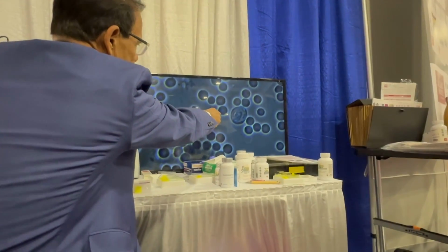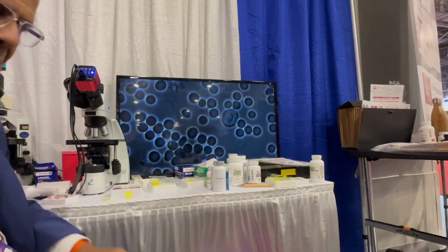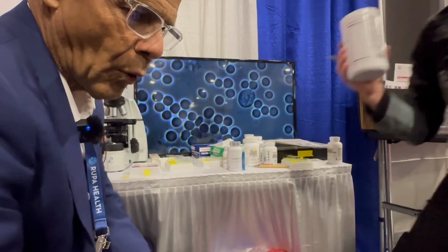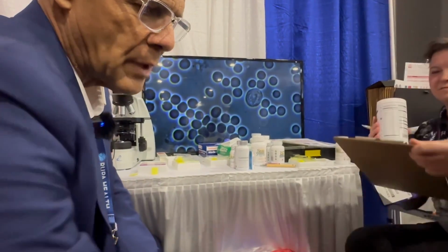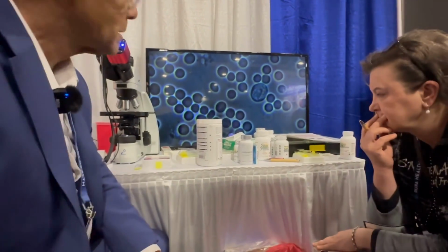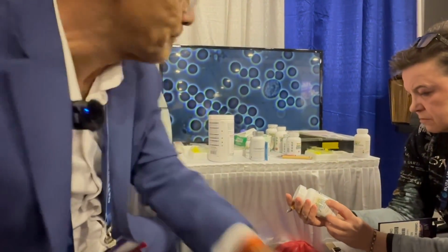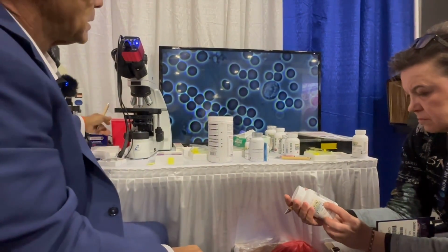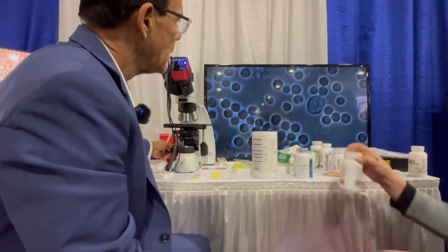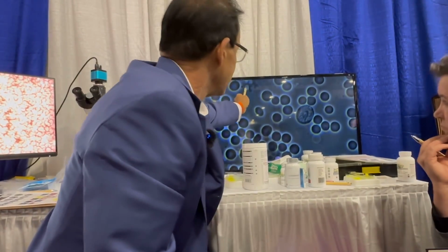What's that big blob? Neutrophil? Right. So you take a look. Is it a monocyte? If you said neutrophil, that has more granules in it. So I would say it's more of a monocyte. Well, let's look at it again. No, that's pretty close, right? It could be a basophil. To me it kind of looks like a basophil, histamine. Okay, I am congested in Las Vegas, ever since I got here. Got it. And again, what is this?